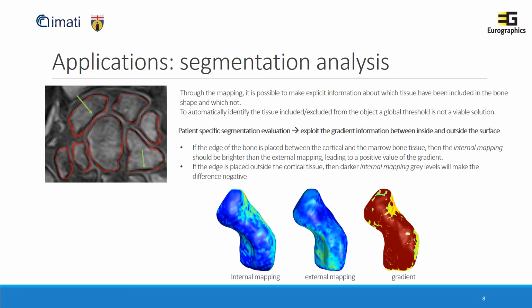Once we have obtained the integration of volume information on the surface model, studying both texture and geometry information, we can find different applications useful for clinical practice. Indeed, we can improve those descriptors that previously were related only to shape and geometry. This means providing medical doctors with key information while solving classification, annotation, and landmark identification problems on this 3D enhanced surface.